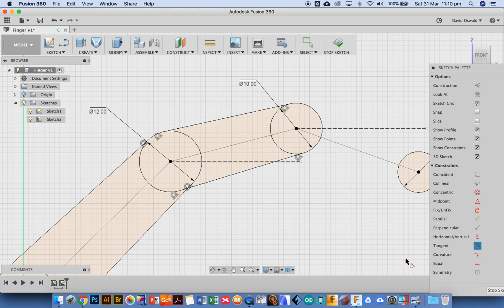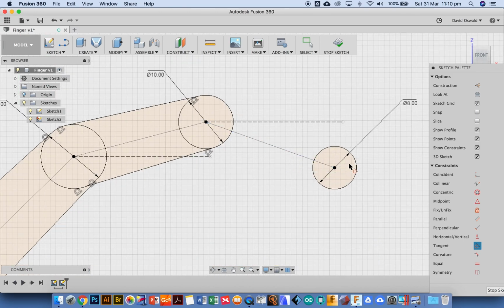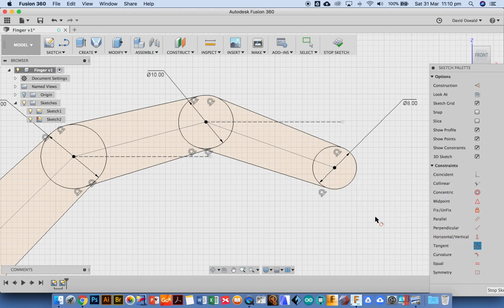You'll sometimes get an error message saying you've got too many constraints. That's fine. If you do get it, just delete it. Zoom out, zoom in, L for line. Click on both of those. Somewhere over here. Click. I've already got one again that's locked on there. I'm going to go back to tangency tool, line to circle, line to circle, line to circle. Just check. There's that error message there. If you get it, click on it and delete it.